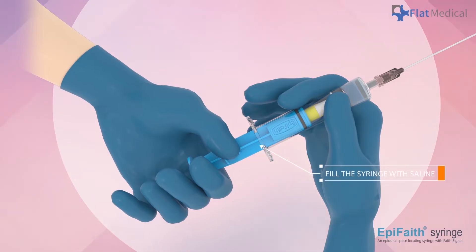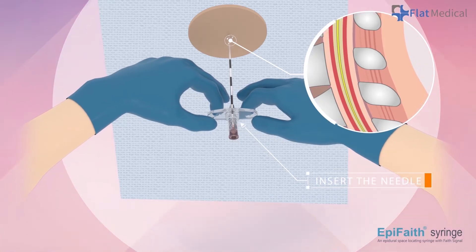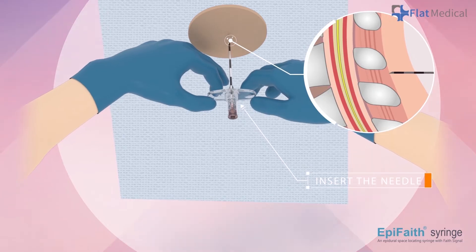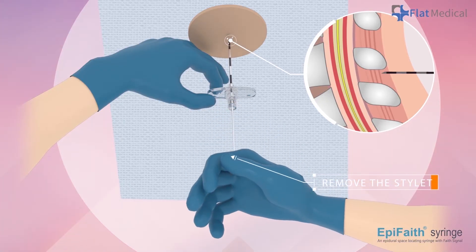Pull the plunger to fill the syringe with saline. Insert the needle until the needle tip reaches or approaches the ligamentum flavum. Once the needle is accurately positioned, remove the stylet.